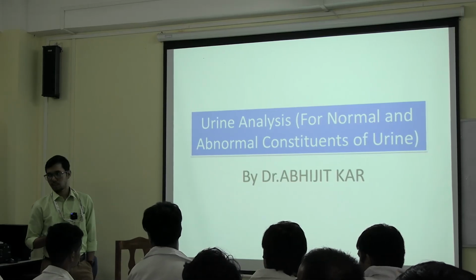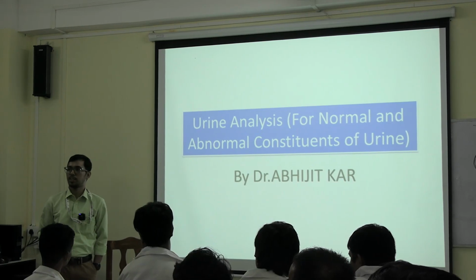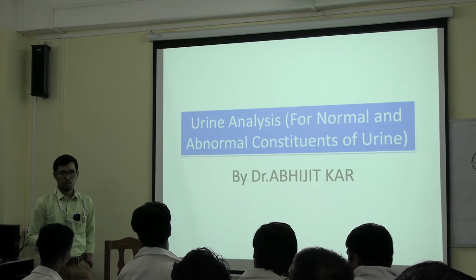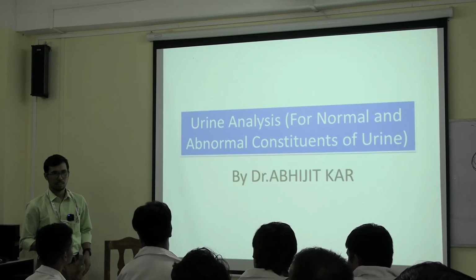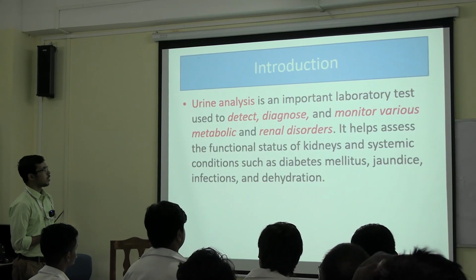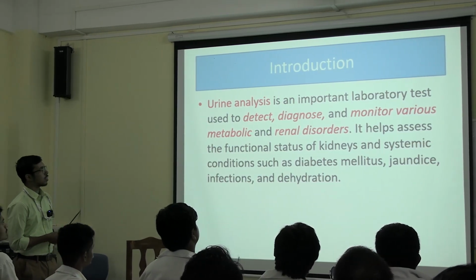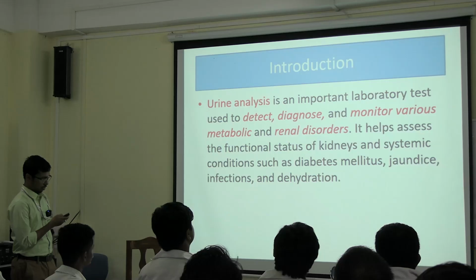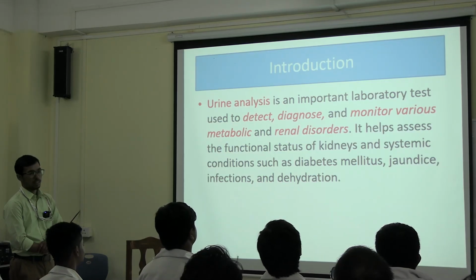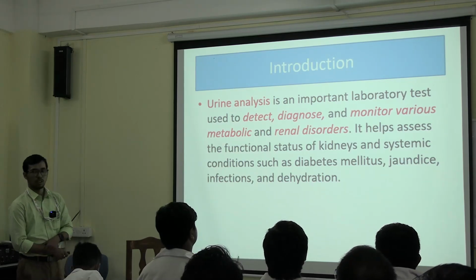Okay. Let's say there is a disease called diabetes insipidus, where too much urine is passed, so it also becomes dilute. Okay, dilution of urine. So, introduction. Urine analysis is an important laboratory test used for detection, for diagnosis and to monitor various metabolic and renal disorders.